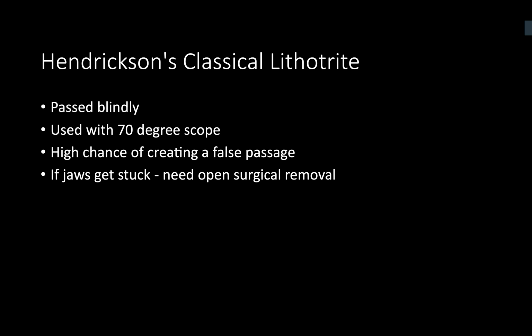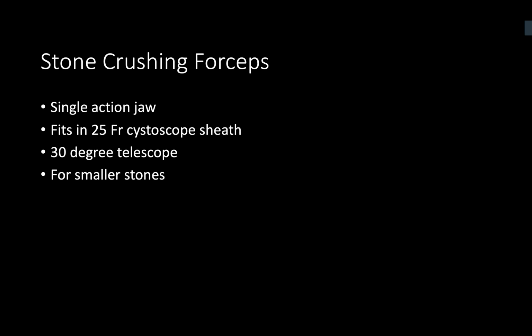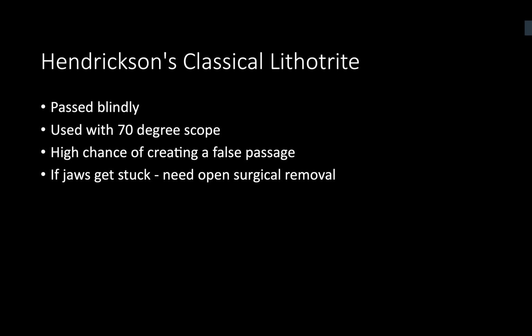There is one, just for the discussion purpose only. Previously there was one called Hendrickson's lithotrite. What we used to do was to pass it blindly and then feel the stone, and then we had to use a 70-degree scope. But we had to know about the Maurmyer's stone punch and also about the stone crushing forceps if asked.